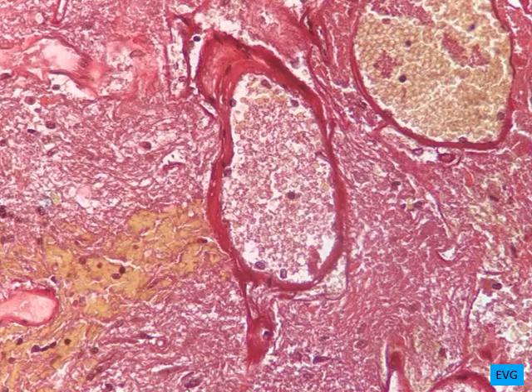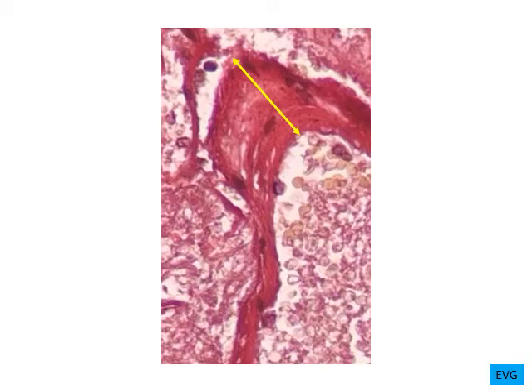But in a few places, especially in areas that contain brain parenchyma in between the vessels, you can see thick wall vessels. In these instances, they are more like arterioles or venules, small arteries or small veins, where the vascular wall is a little bit thicker compared to the initial vessels in the first fragment. So this is just to demonstrate the thickness of the vessel wall.